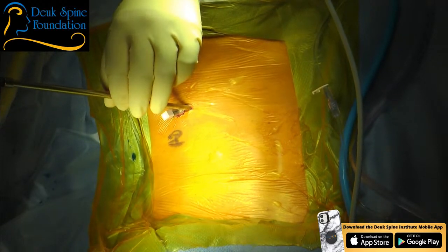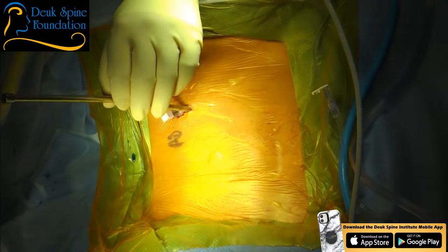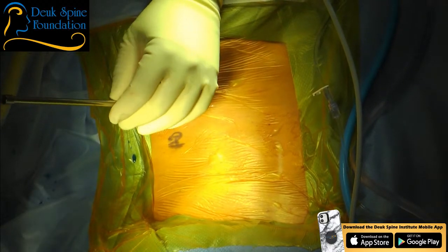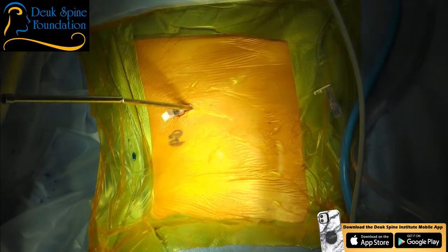So you all see the tip of that dilator? It looks like a pencil coming in from the right side to the left. It's literally sitting right where the dye ends. The dye is wrapping around the herniation. That's a big herniation. Whenever you're ready. And if you look at the MRI, the herniation's not that big on the MRI. Okay? So why is it big here?